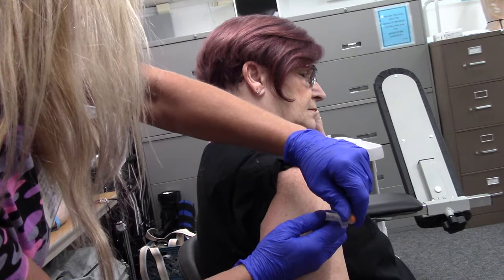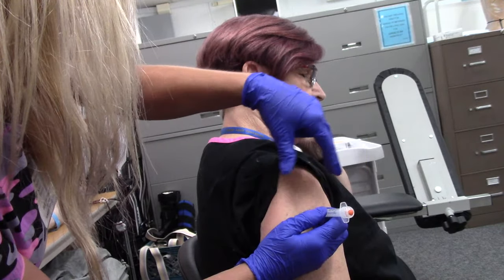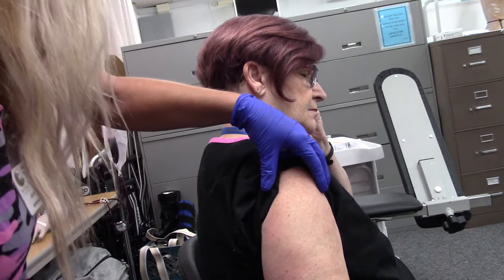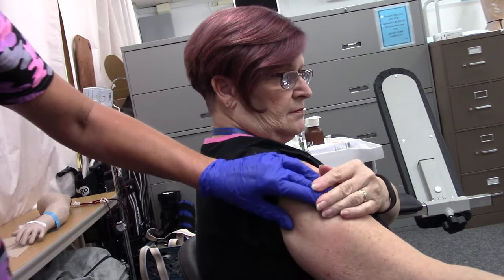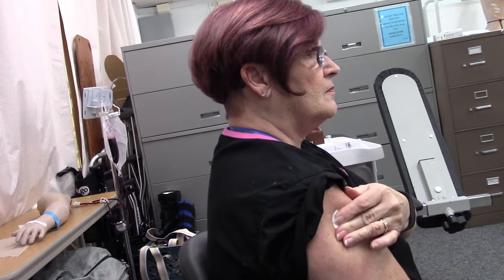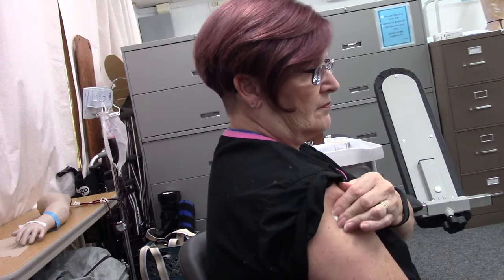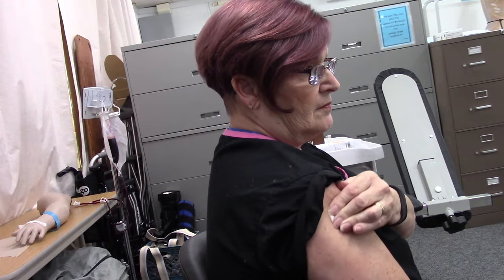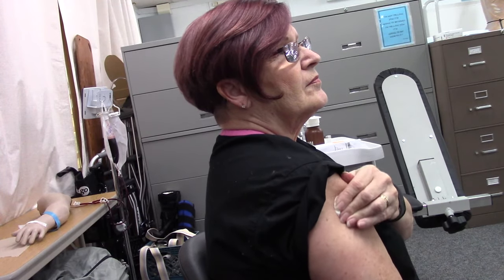I'm going to show you how to aspirate — they don't require it on all injections anymore. Straight out. Place a cotton ball over that muscle and put a little pressure on it. You can massage it, as long as the vial and the medicine don't say 'do not massage site.' Generally, massaging the muscle helps the medicine disperse better and makes their arm feel better later.